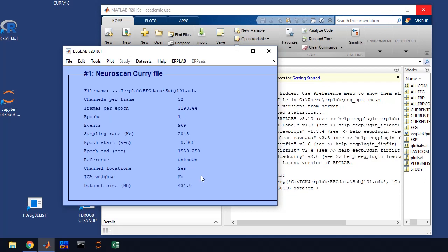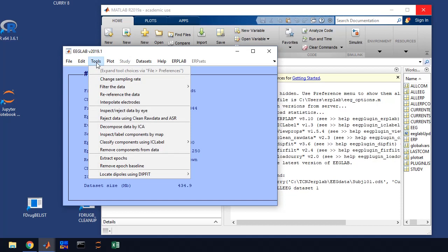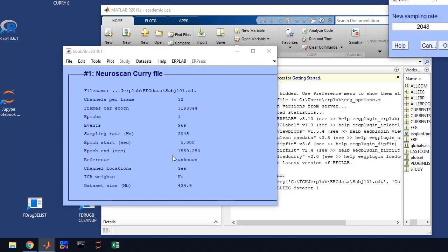Now the first thing that we're going to do with the data file is we're going to change the sampling rate. You'll see the sampling rate is 2048 Hertz. That's super high, we don't need that many samples. We're going to downsample. This will decrease the file size and make things a little bit easier to process.